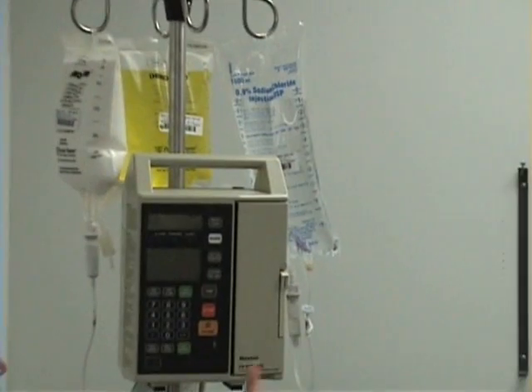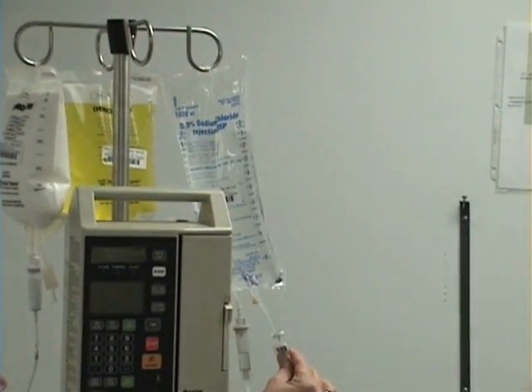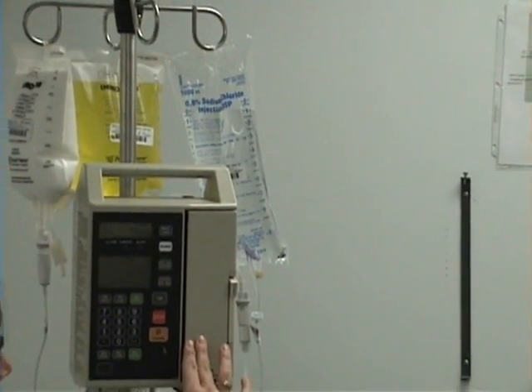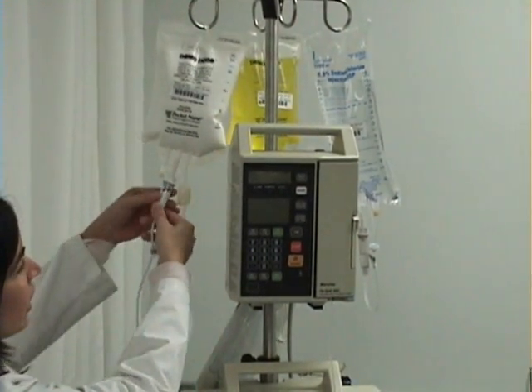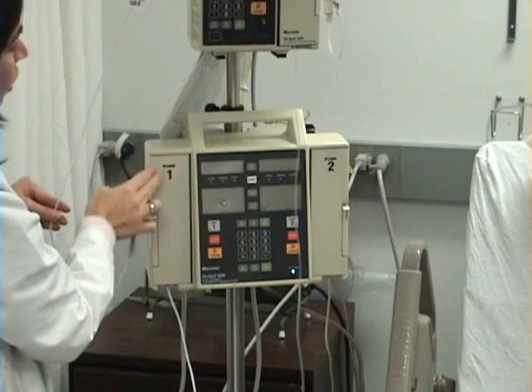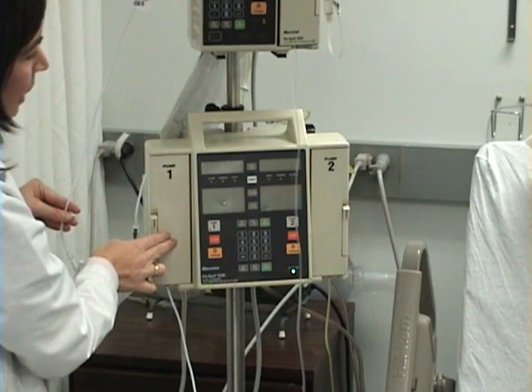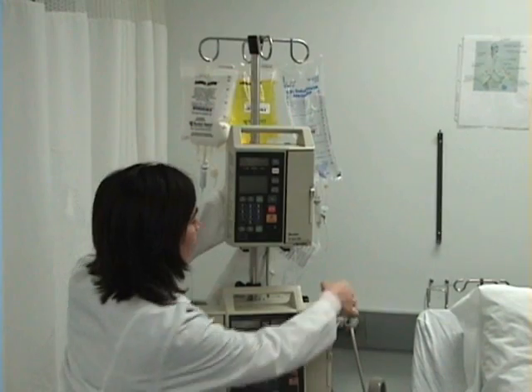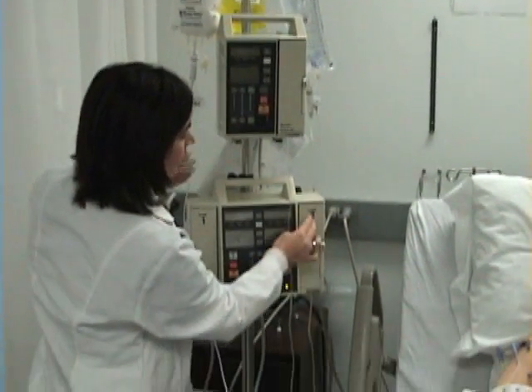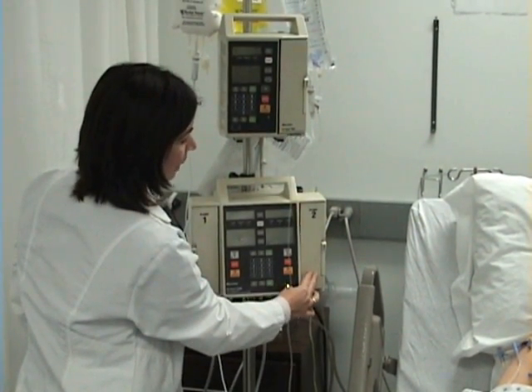I have a patient with a triple lumen subclavian central line. The patient has normal saline running through one pump, hyperalimentation or HA running through this side of the double pump, and vitamin B12 running through this side of the double pump.